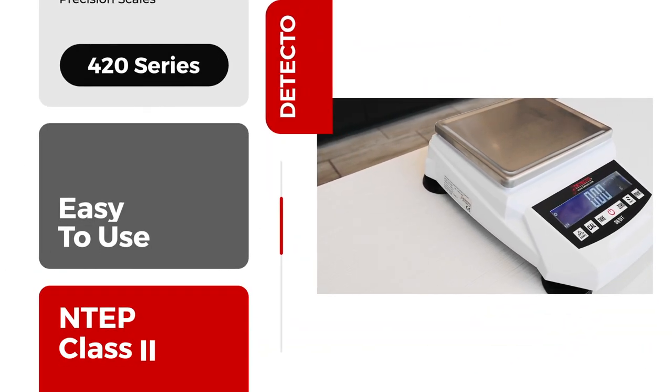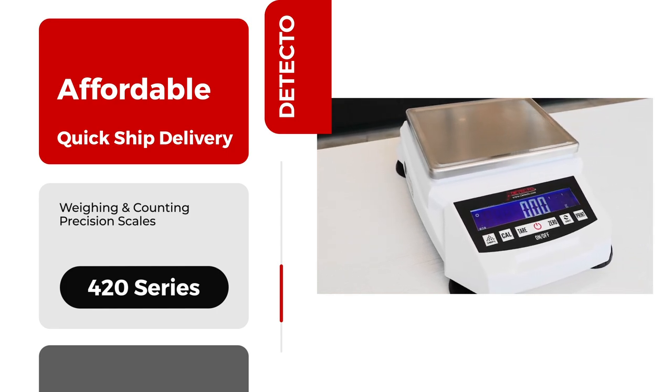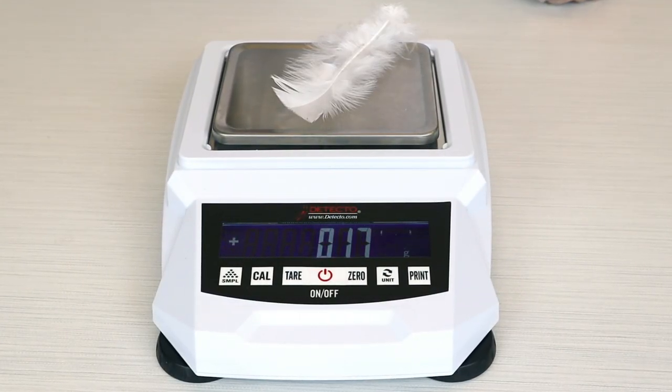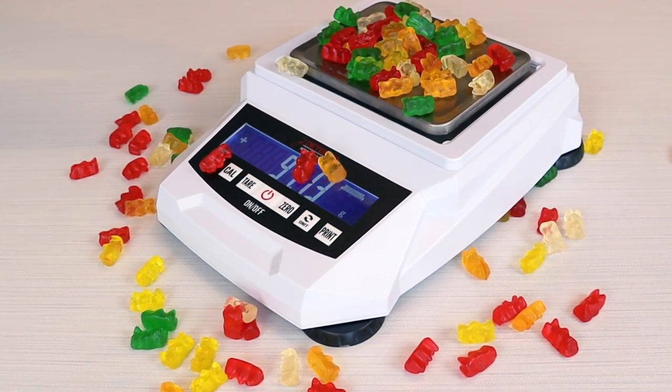The 420 series are the highest precision scales in Detecto's product portfolio, with increments as fine as 10 milligrams. The 420 series are so precise they can register and immediately display the weight of a falling feather. They are economical, compact, precision-balanced scales that can be used for a wide range of minutely accurate weighing purposes.